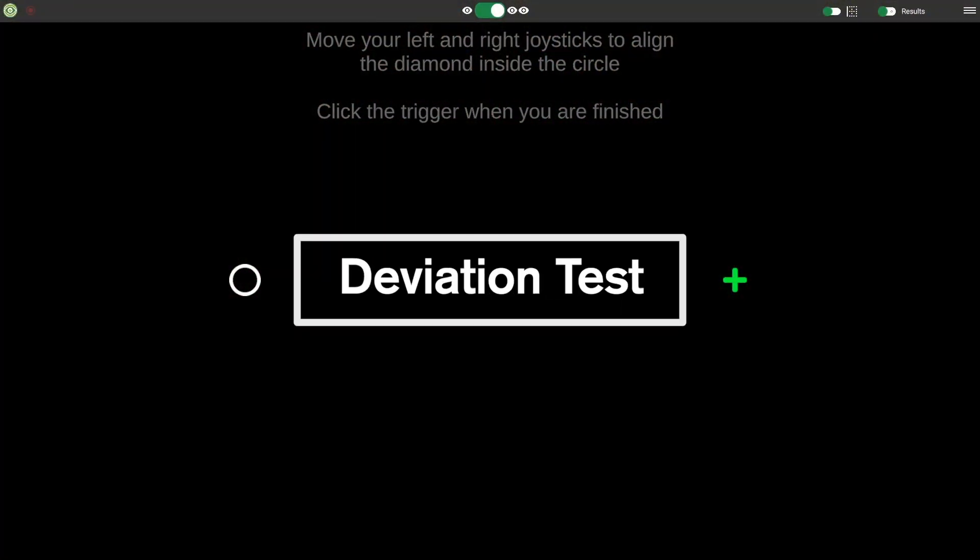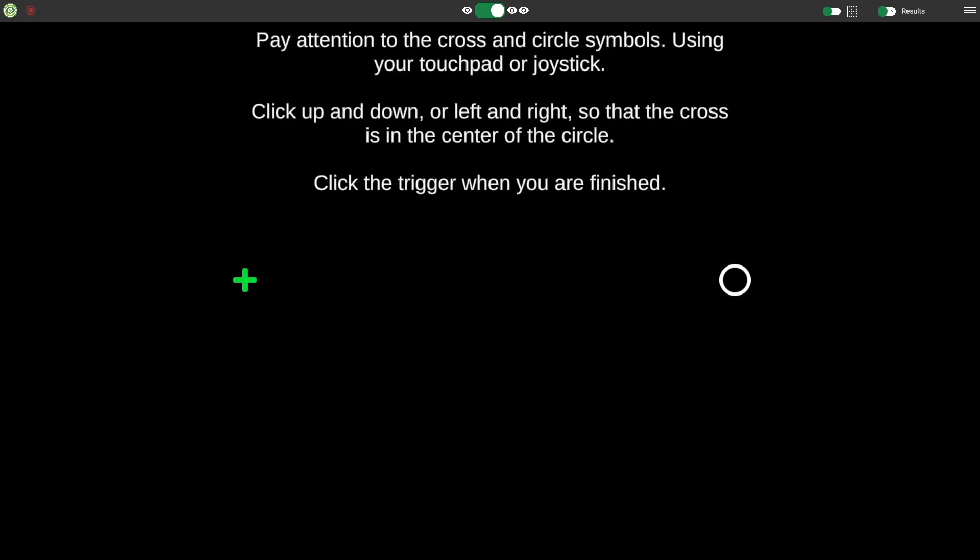Next we have the Deviation Test. This is a baseline test that measures the user's baseline vergence values. You can use this as a tool to see where the user's current fusion ability is. We display a circle and a cross in opposing eyes. The objective is to align the cross so that it is in the center of the circle. Click the touchpad or joystick left, right, up or down to manipulate the two images until they are aligned.